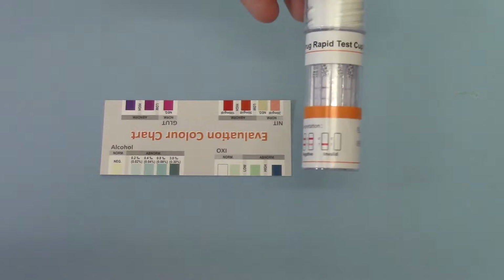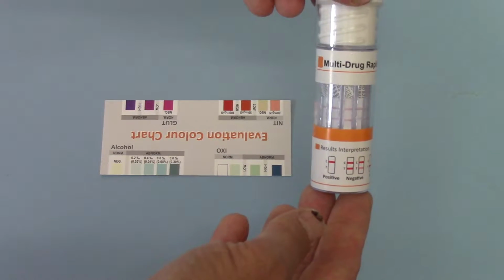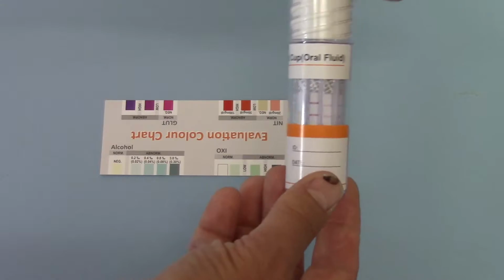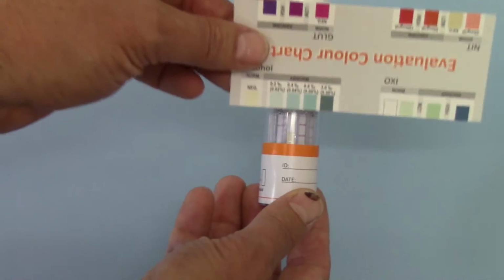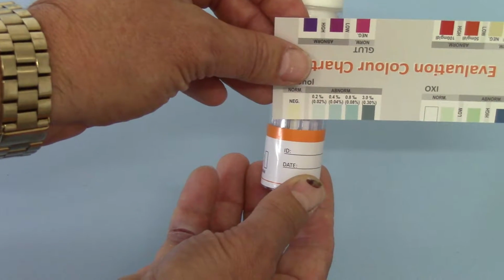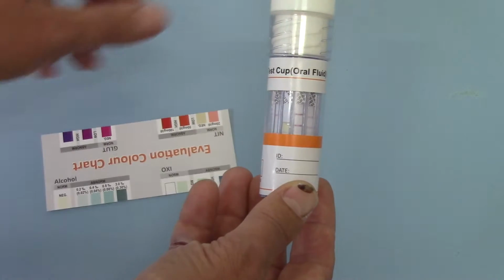So if I just tip the test slightly towards you, I hope you can see that on camera. If I rotate it round, you will see initially, if we have a look at the alcohol test membrane pad, there's been no colour change there, indicating zero alcohol has been detected in this saliva sample.